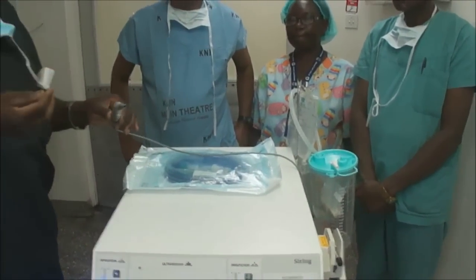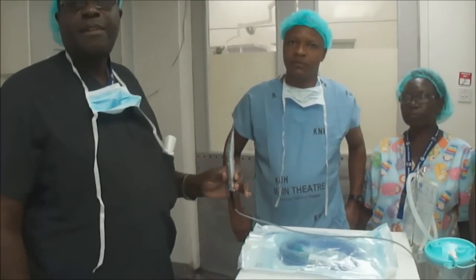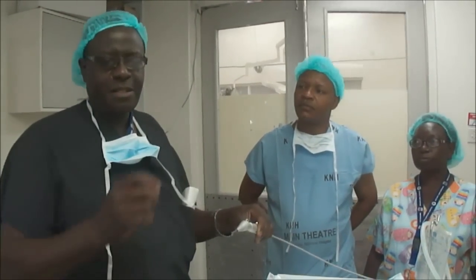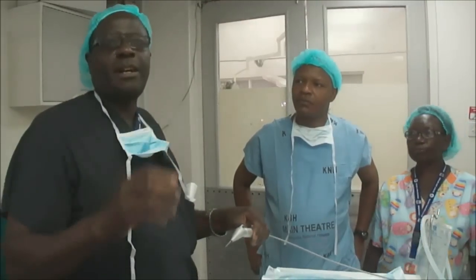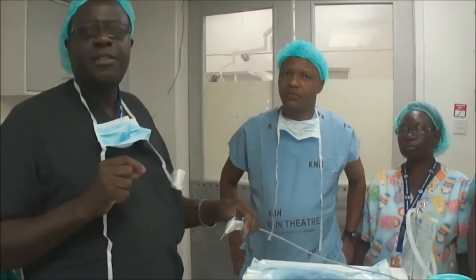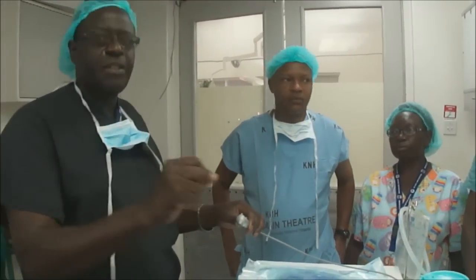With a deviation of plus about 0.5 or 0.2. These values are very important — to know exactly where the tumour is. If you have excess current, there are certain layers and tissues in the body you can't cut with so much current. That's why the intensity matters a lot. The frequency you are giving is also very important, so you avoid affecting other tissues and go to specific sites.